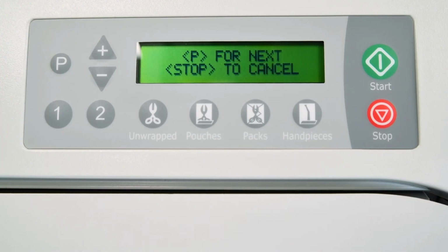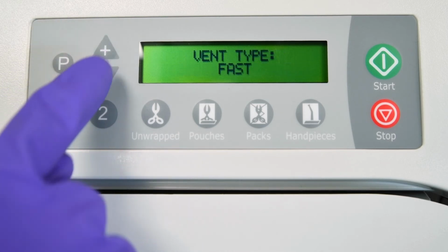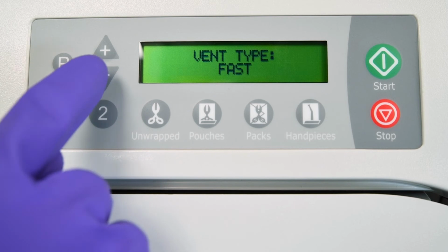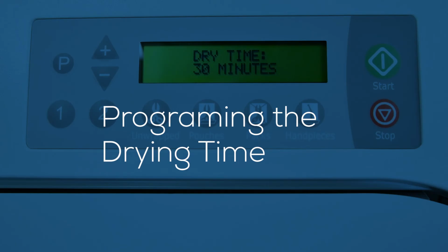If the settings are stored, the display will now show vent type and the current value. The user must choose between the fast or slow vent options. Pressing the plus button sets the sterilizer to fast vent, so the vent valve will fully open and vent the chamber quickly. Pressing the minus button sets the sterilizer to slow vent. The vent will open for a fraction of a second once per minute to slowly vent the chamber. Press P to store it.